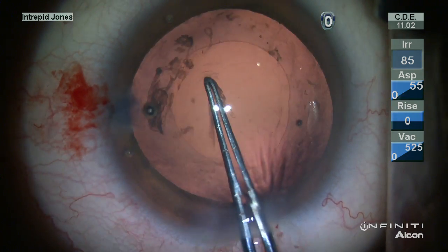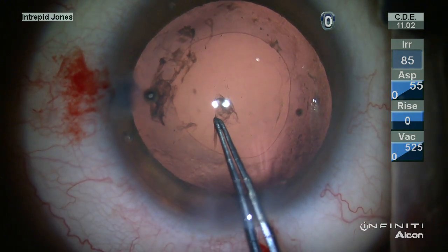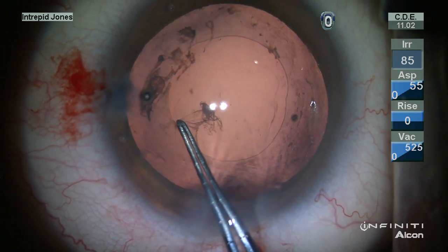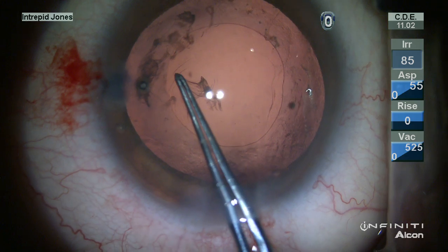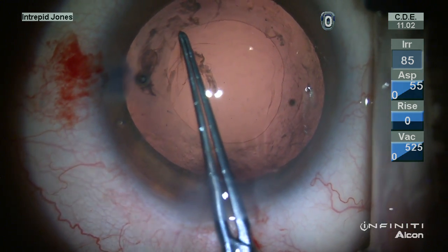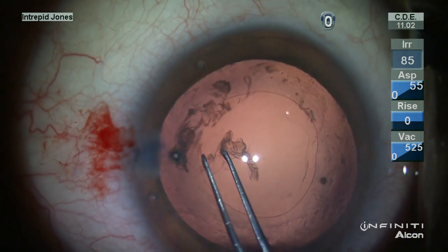As you can see here in the sub-incisional region, going across these areas of fibrosis, extra care and gentle maneuvers — short maneuvers of tearing — are helpful to ensure that the capsular tear is indeed propagating in the direction that's desired.